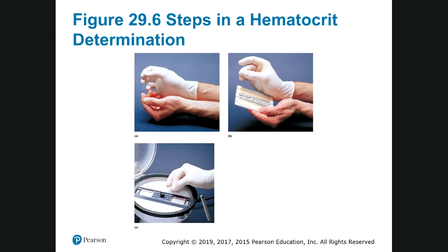Usually we use two or three of them, and you put them in the centrifuge. If I look at it there, I am going to zoom so you can see it with size. If you look at it, this is the size with the blood, the hematocrit. You have to face outside, not inside.